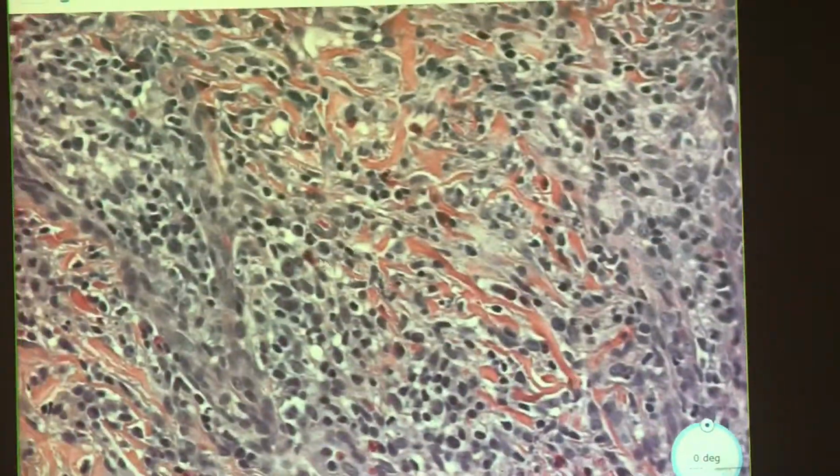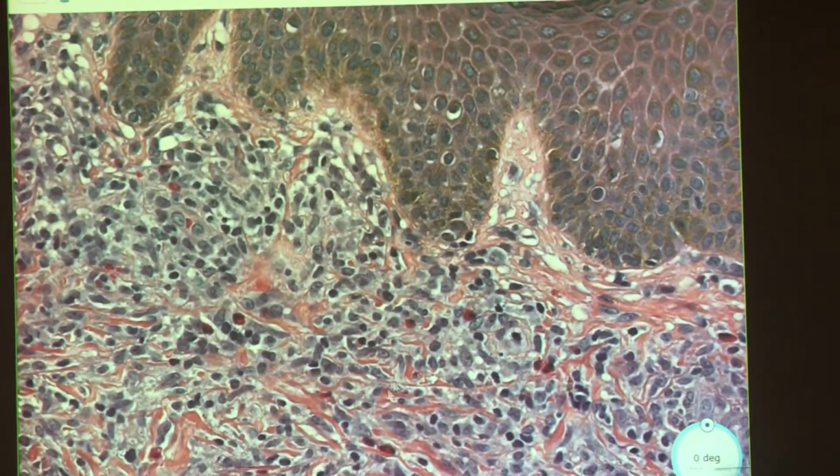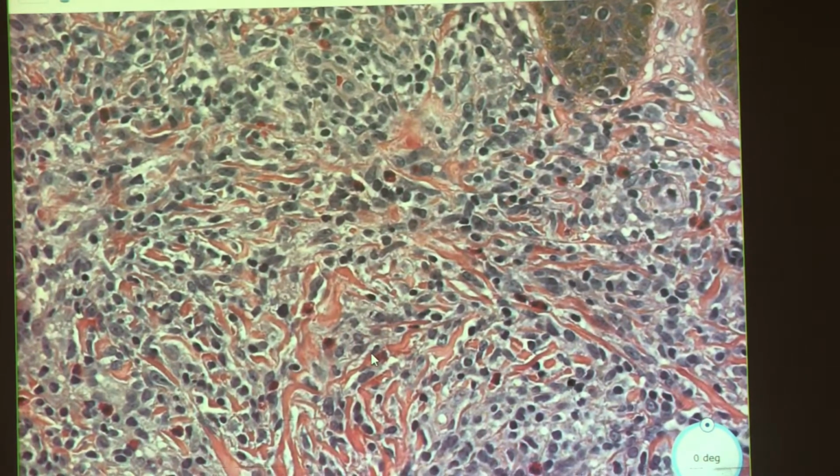And it's not tea, and it's not juice or milk. Talking about coffee. So these are coffee bean nuclei. Coffee bean meaning that they're either slightly ovoid, elongated with a curve and groove. They can be lobulated in appearance too, and that's still okay. If they have a nucleolus, it should be very small, which is great because that's all fitting with what we have here.